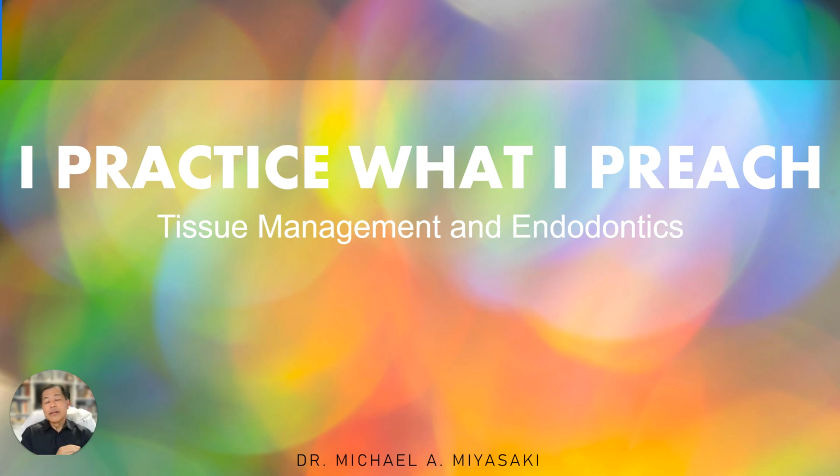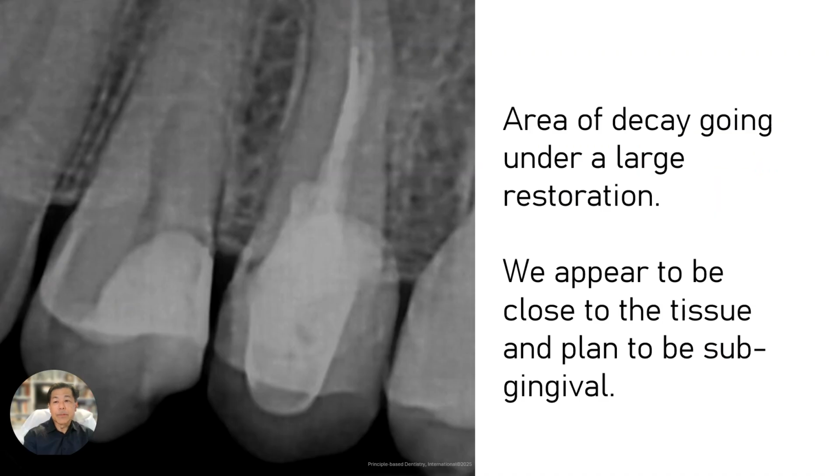And yet, I talked to some clinicians who let me know that, hey, I've tried QuickStat Free and I love it too. And then I've talked to other clinicians who tell me that they've tried QuickStat Free and it's not working well for them. So one of the things I want to discuss was the use of QuickStat Free in your tissue management, and just show you an example of a case that I had yesterday. And let me just get into this part of the program.